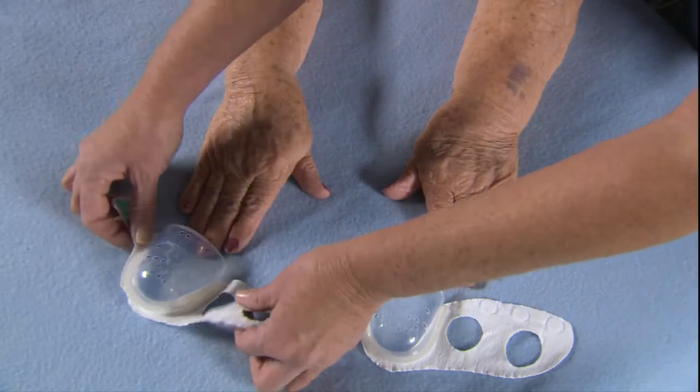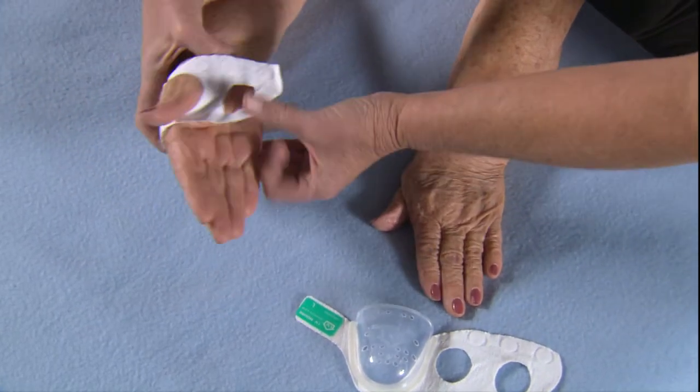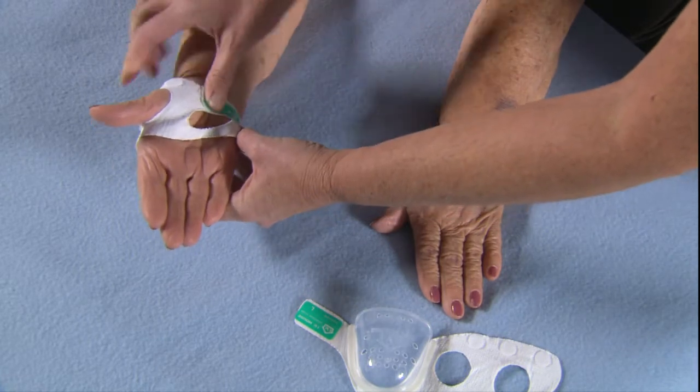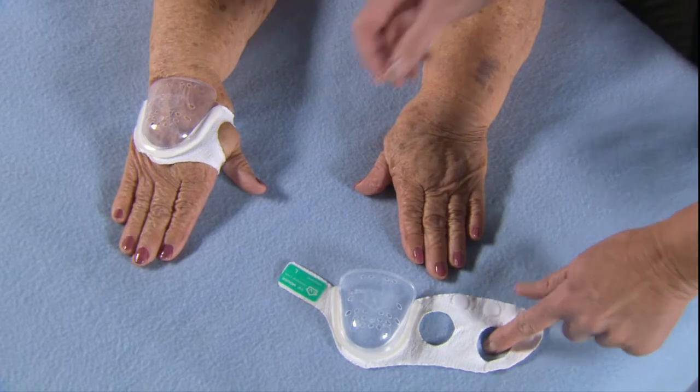For the right hand, slip the thumb through the hole closest to the dome. For the left hand, slip the thumb through the hole farthest from the dome.